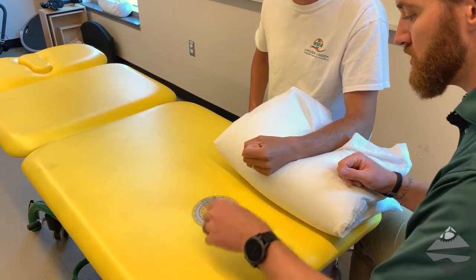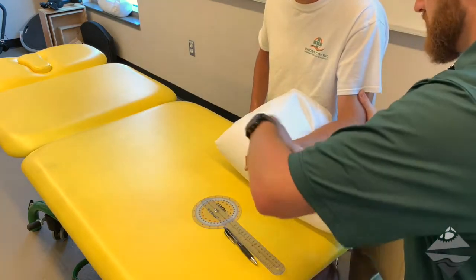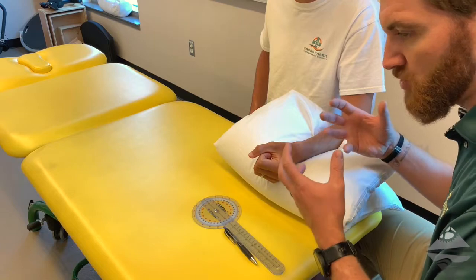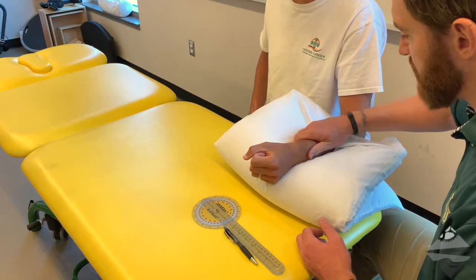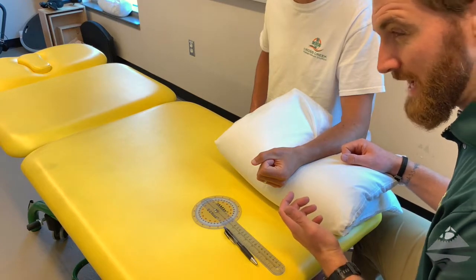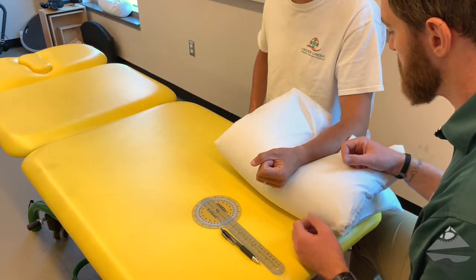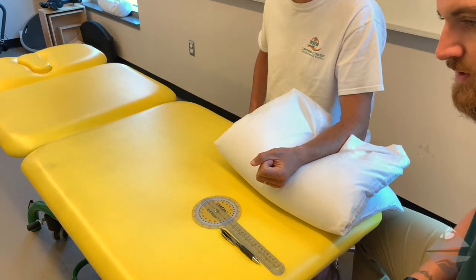You can also provide overpressure while they're in this position — for pronation overpressure, using the styloid processes as a grip source is helpful because it gives something more firm to grab hold of rather than creating a shear force across the skin. You can also look at those measurements passively. So start with a palpation assessment and observation, move into your range of motion assessment utilizing goniometric assessment, and let me know if there are any questions.